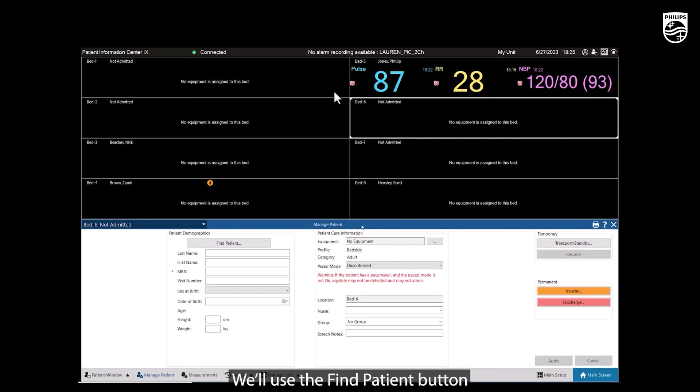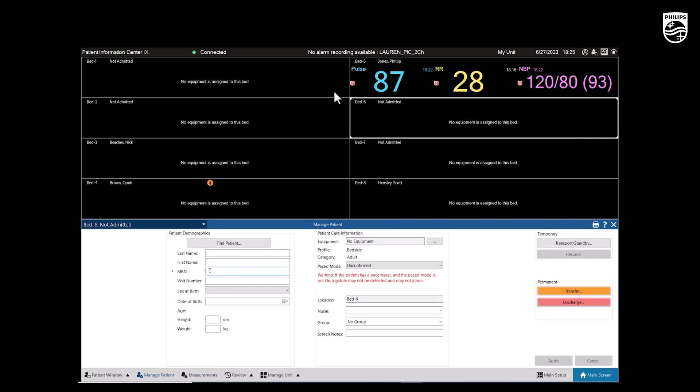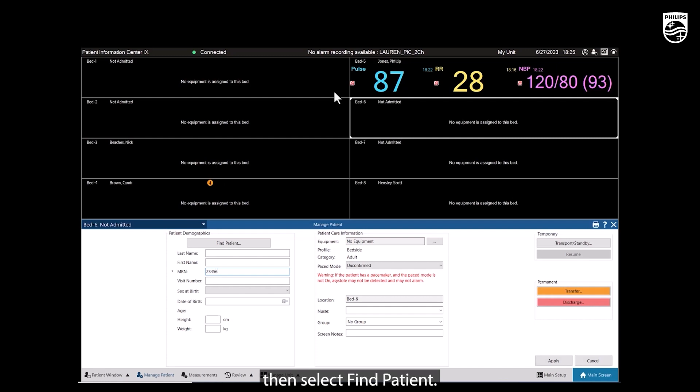We'll use the Find Patient button to find the patient that we want to readmit. Enter the patient's MRN, then select Find Patient.